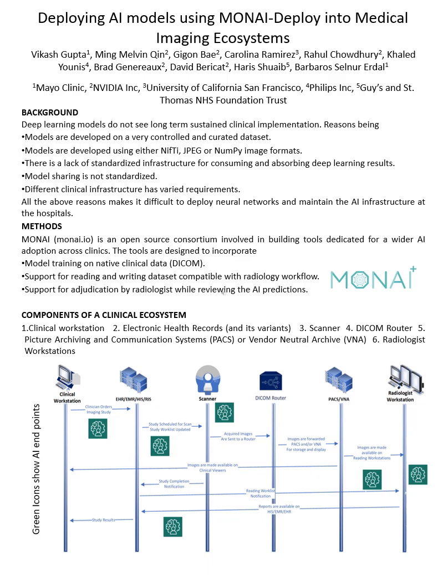Most people think that this is the only place where AI is used. However, in the figure you can see that all the green icons are the places where AI can be used for improving the clinical workflow. MONAI Deploy is working on and providing such endpoints for deploying AI models.